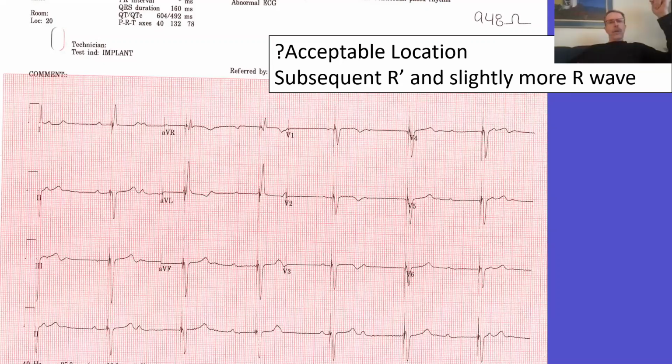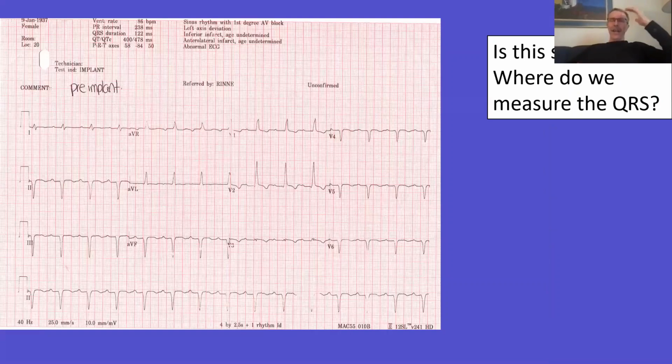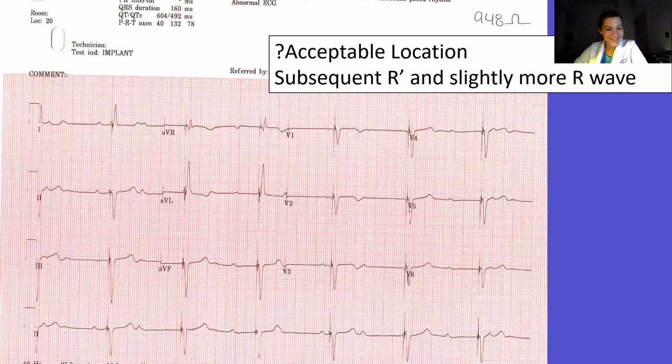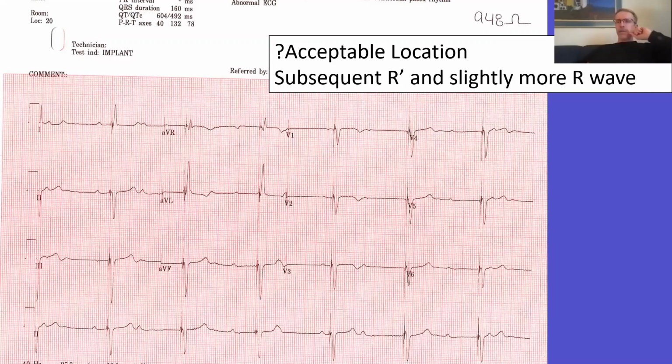So I, of course, decided I was going to try and do better than that, and that was a very bad idea. I can tell you that a long time went by before I finally got it. Anyway, live and learn. So you guys would accept that? Yeah, I would accept it. I think it's amazing. Lower and more apical, but still a narrow QRS.